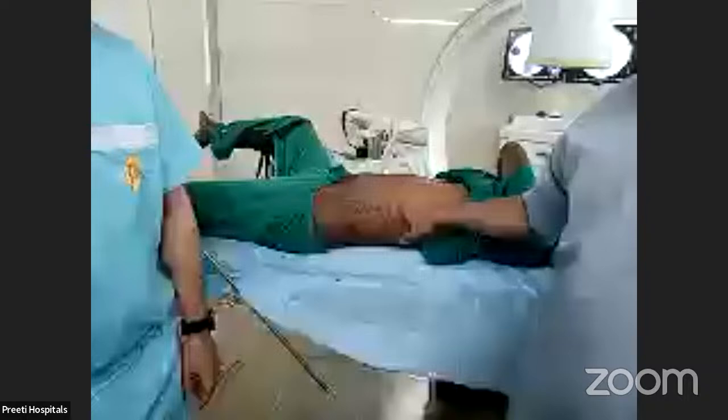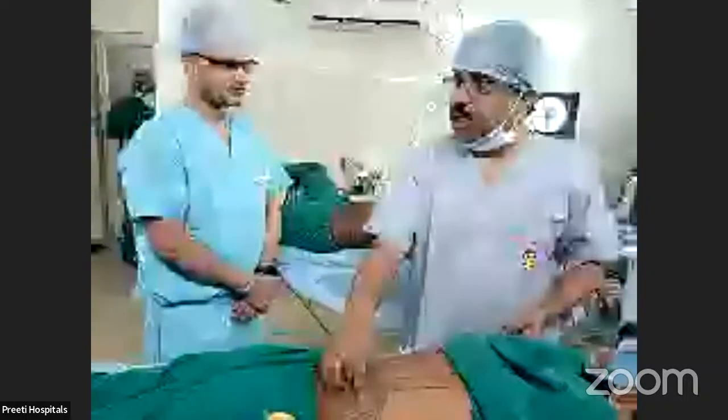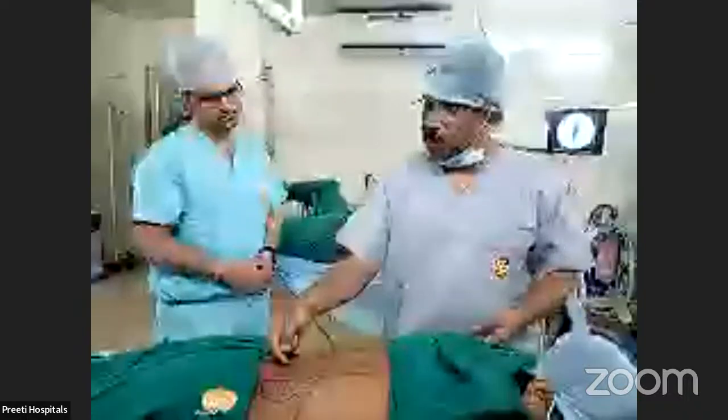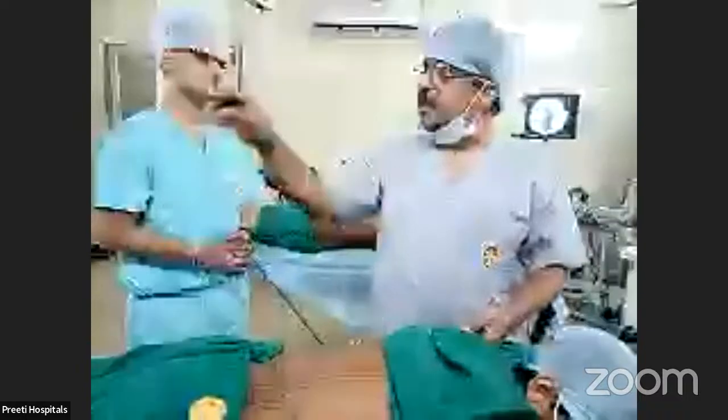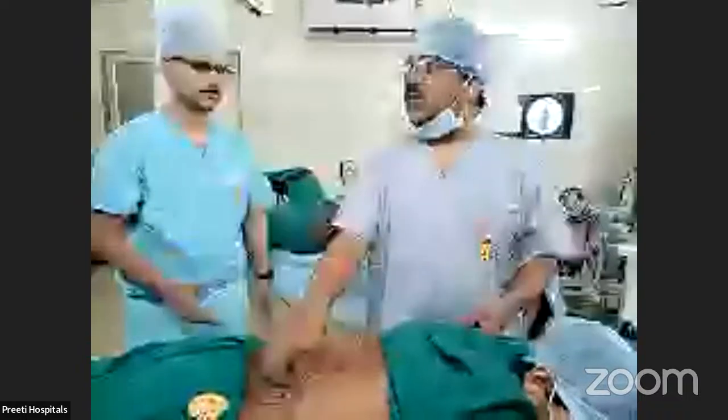Now an important discussion arises. Now you have a pelvic stone, and very small stones in the middle and upper calyx. What will you do? Supine PCNL is better, supine is easier. You do a middle calyx puncture, remove this, take the flexible scope, and take out all these stones and bring them to the nephrostomy tract of the middle calyx.